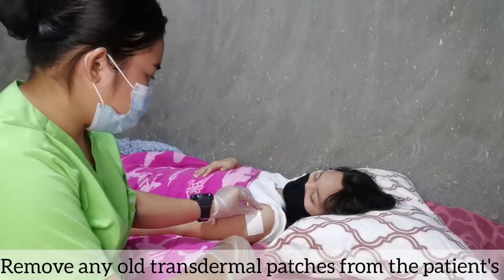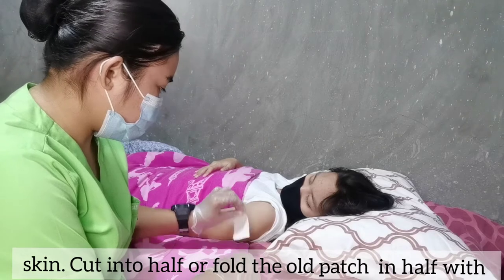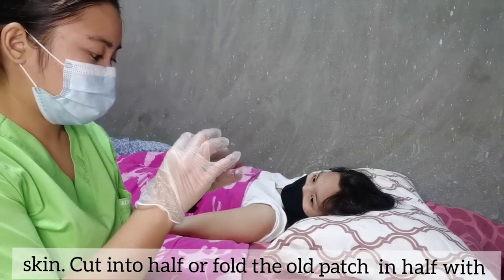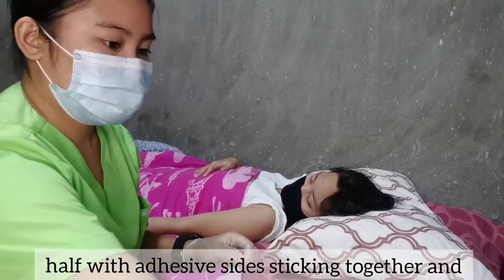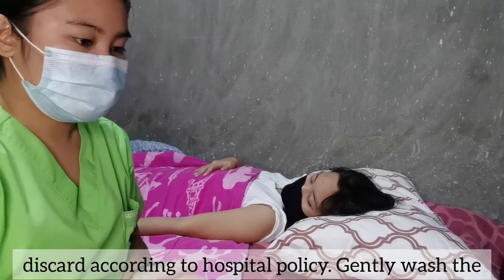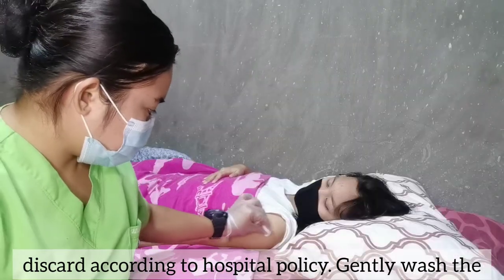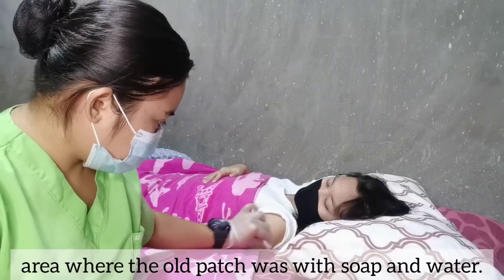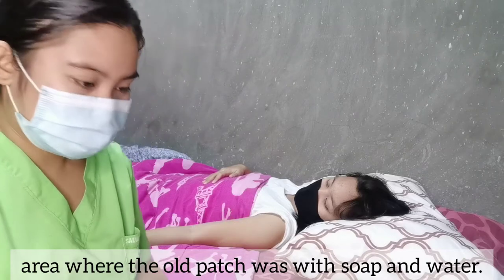Remove any old transdermal patches from the patient's skin. Cut in half or fold the old patch in half with adhesive sides sticking together and discard according to hospital policy. Gently wash the area where the old patch was with soap and water.